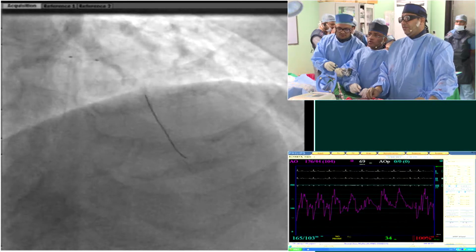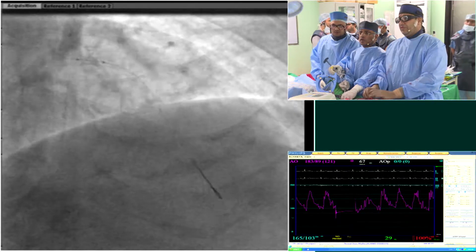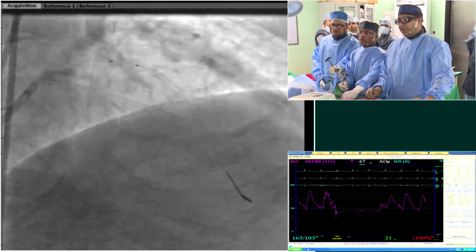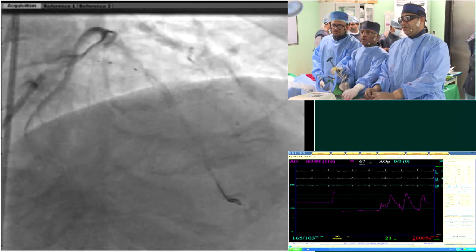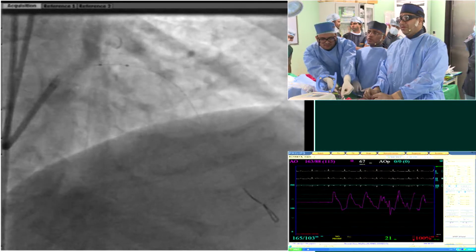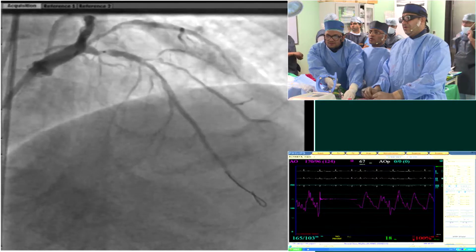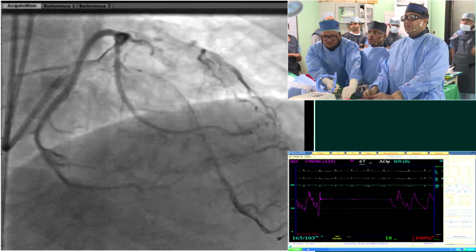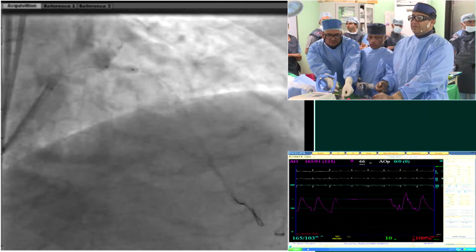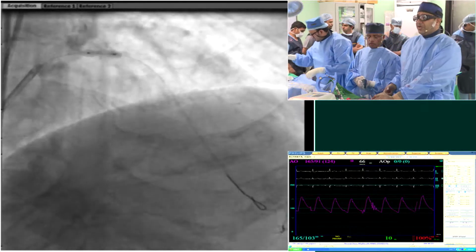What is your choice of anticoagulation for this case? We've used heparin. Do you all use bivalirudin regularly, or what? Most of the cases at our center are using heparin in the setting of this type of PCI, but Angiomax is used selectively because of cost.